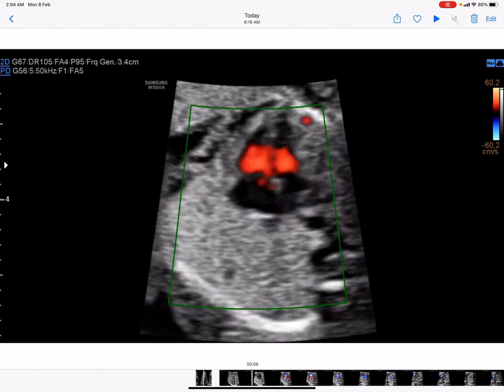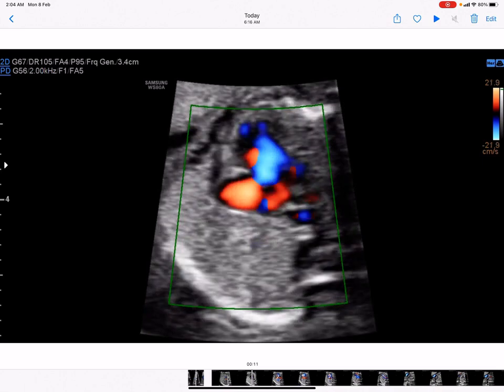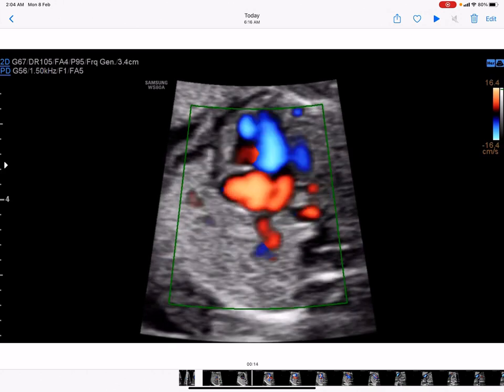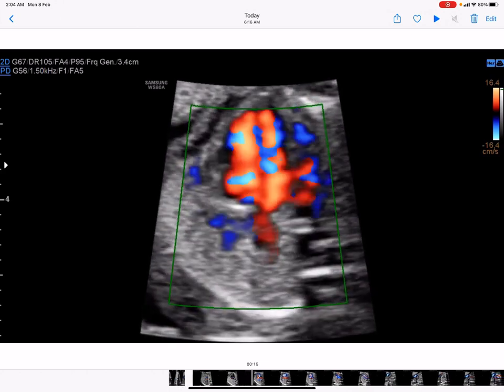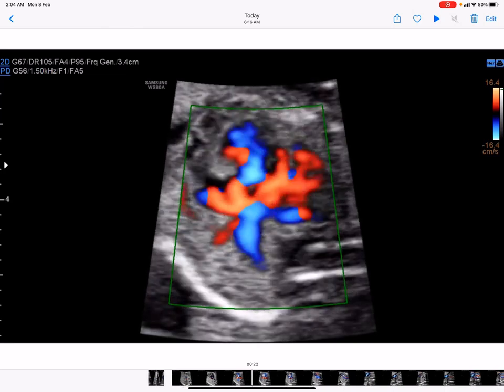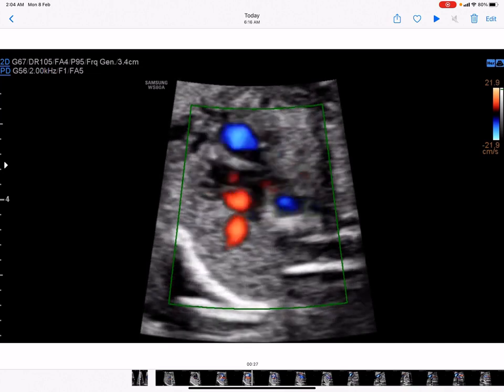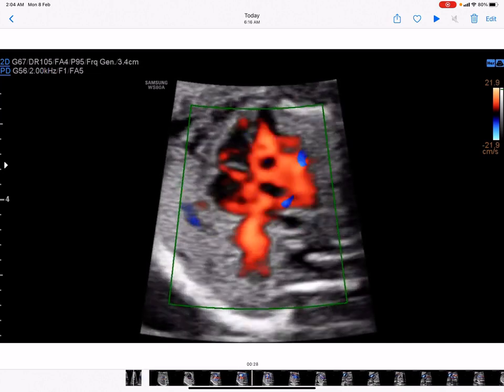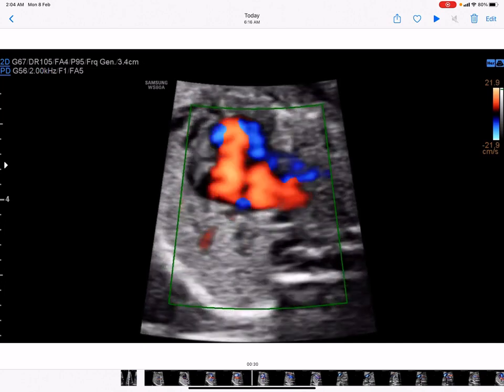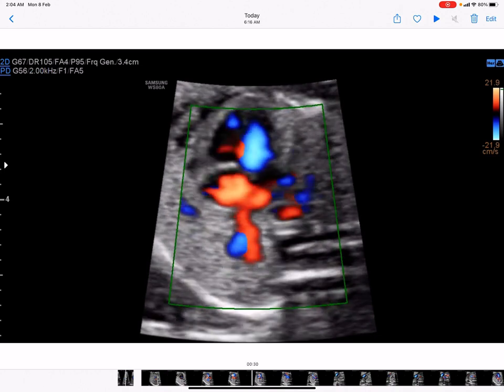As soon as we reach the 4-chamber view, we decrease the PRF. Look, I'm decreasing the PRF. We have to make it somewhere around 20. Look, now this is somewhere around 20. So we can see the pulmonary veins draining into the left atrium. So this will rule out TAPVC as well.